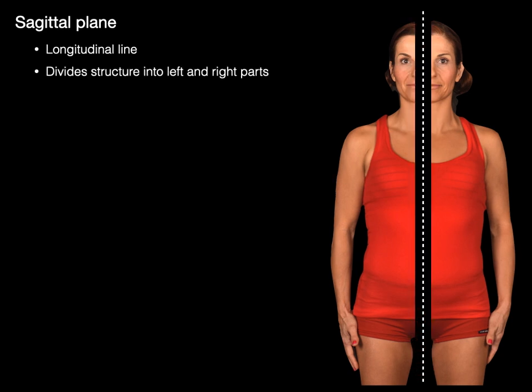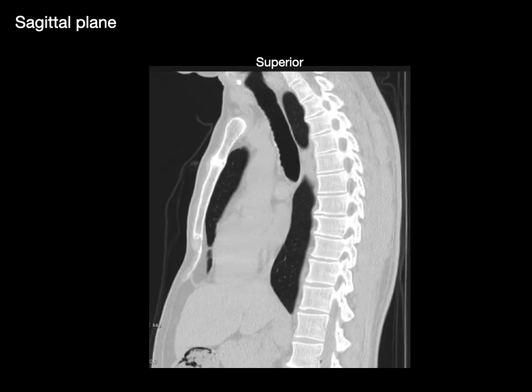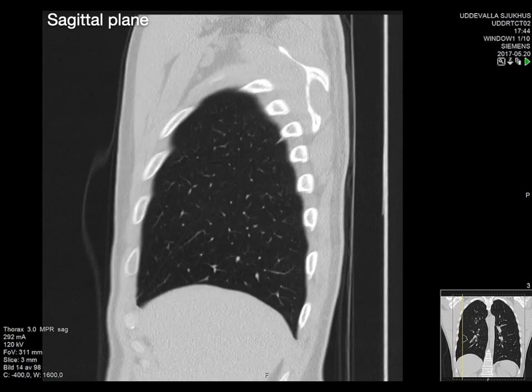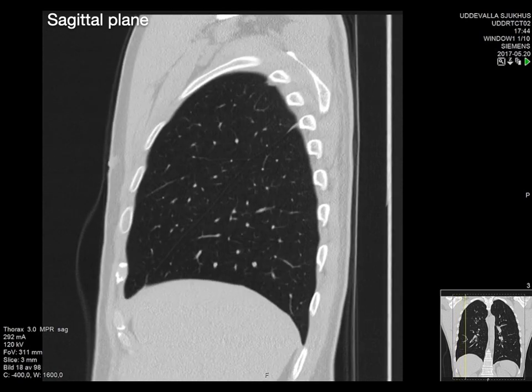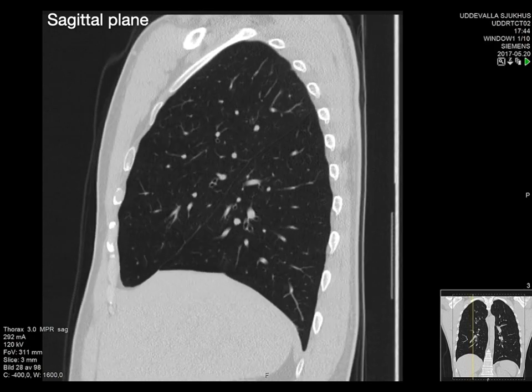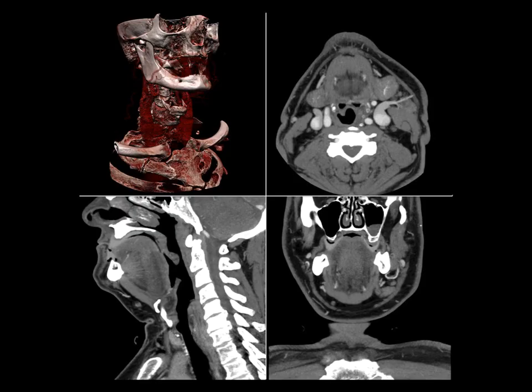A sagittal plane is a longitudinal line that divides the structure into left and right parts. This plane shows superior and inferior, anterior and posterior as you move through the image in a sagittal plane. You see the same thoracic anatomy in a really cool different view.